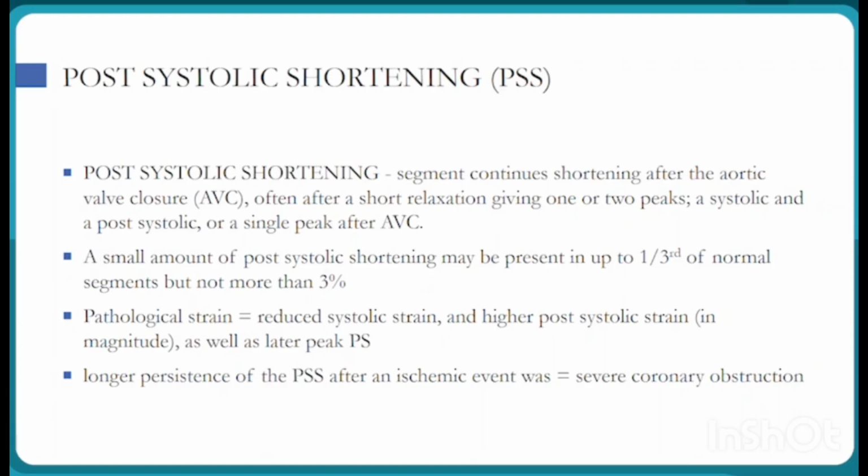Then there is post-systolic shortening. In post-systolic shortening, the segment of the myocardium continues to shorten after the aortic valve closure. It is often after a short relaxation, giving one or two peaks, a systolic and a post-systolic, or a single peak after the aortic valve closure.